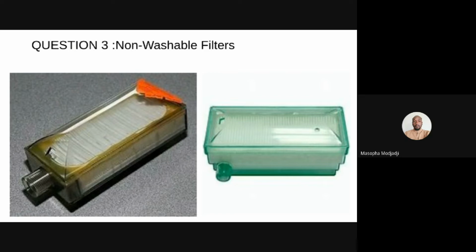Yes, a dirty intake filter would affect the performance of the concentrator. This is so because the clogged intake filter will be restricting the flow of air which is being pulled in by the compressor. Due to the restriction, the compressor is forced to work hard in order to pull enough air for the production of oxygen. As a result, the compressor starts to overheat.